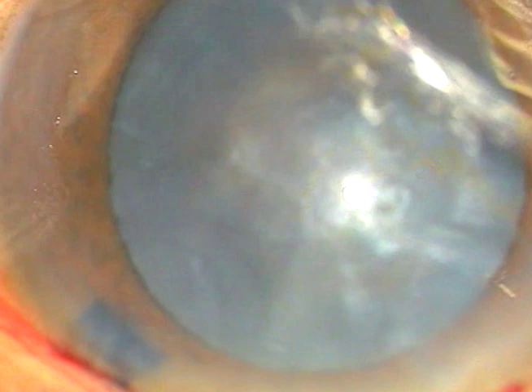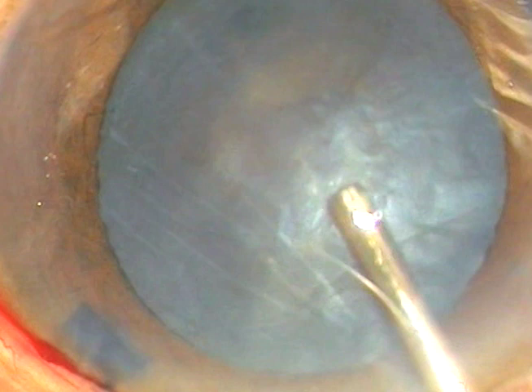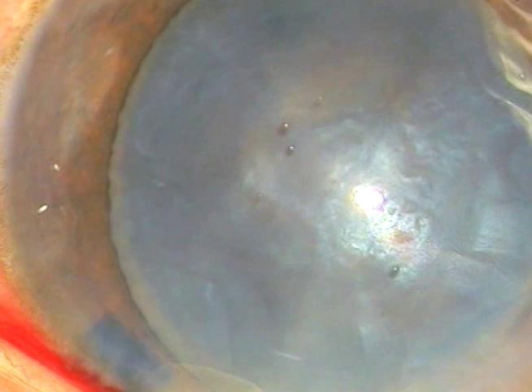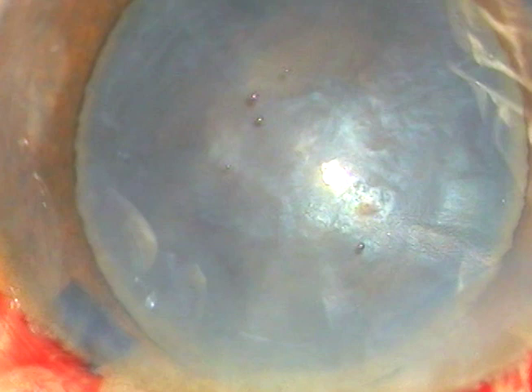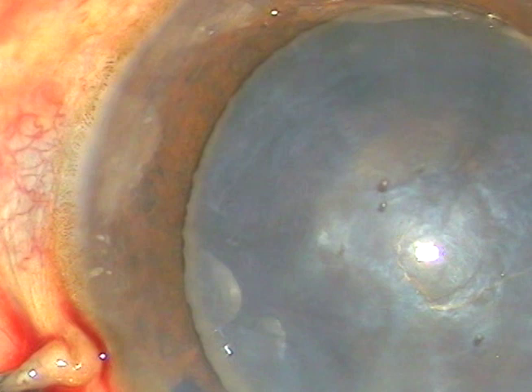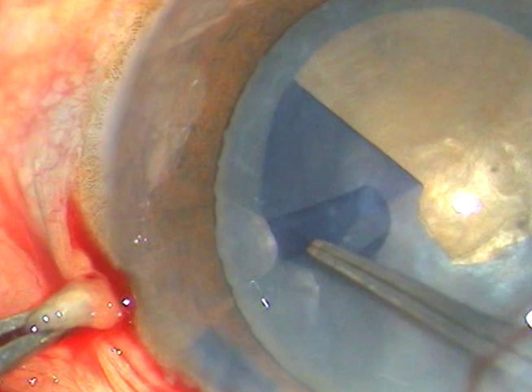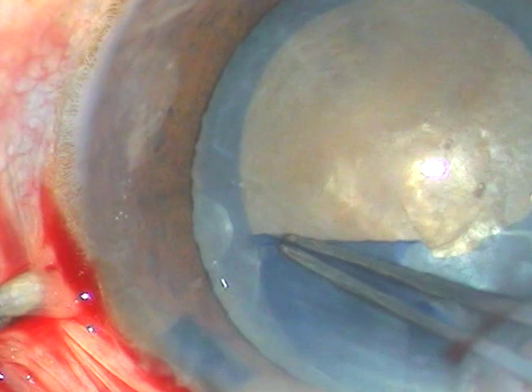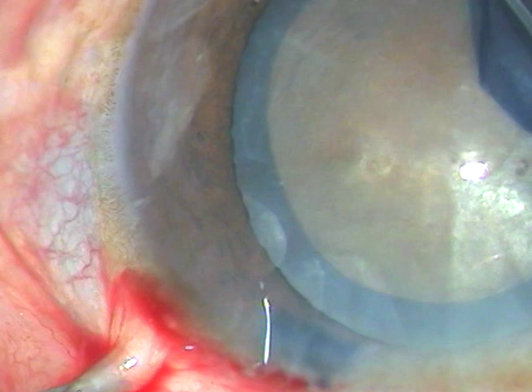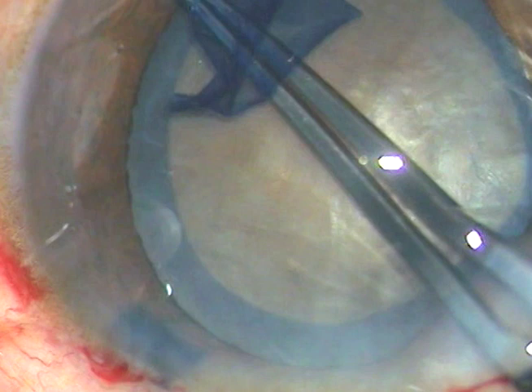If we stain under air, the staining is immediate — the dye is not diluted by aqueous and the staining is very nice and immediate. Viscoelastic substance, HPMC, has been injected into the anterior chamber. Now capsulorhexis is to be done. I incise the anterior capsule with a 26-gauge bent needle and find there is no leakage of any milky fluid, so the interlenticular pressure is not raised. I can do an adequate large-sized rhexis — the cataract is hard and my aim is about six millimeters, which I have achieved in one go.